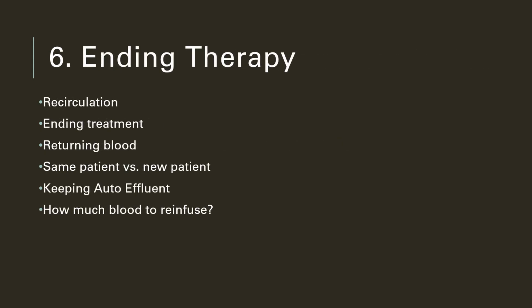A couple things to know on the checkoff for ending therapy. Recirculation can be done with blood recirculation for 60 minutes or saline recirculation, which involves returning the blood, for 120 minutes. Ending treatment, there is a same patient versus new patient option.